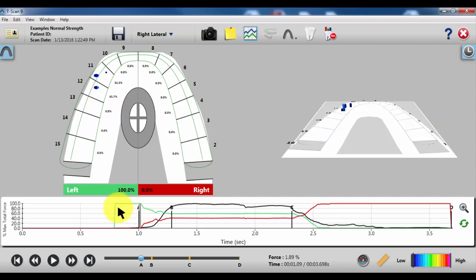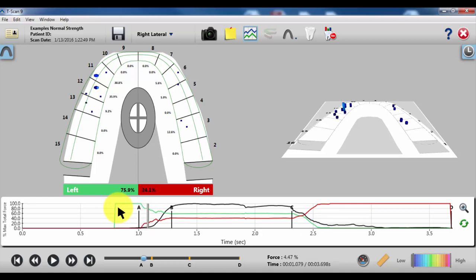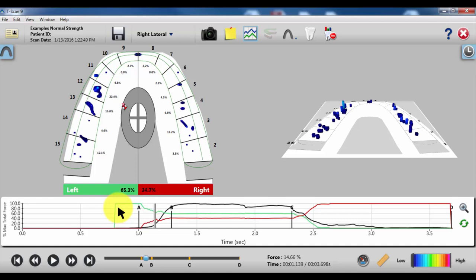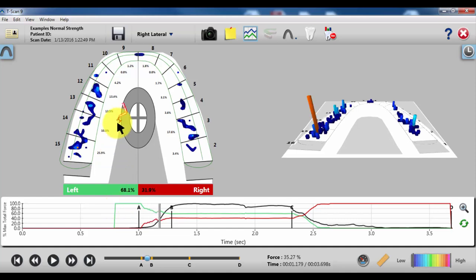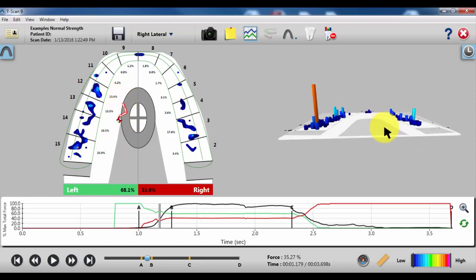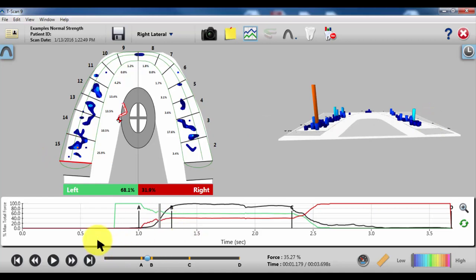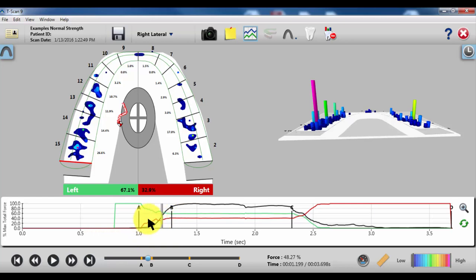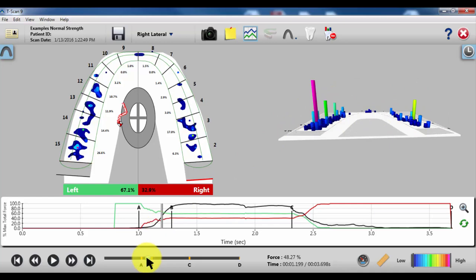If we wanted to find the first contact or first one or two contacts, we would play from the A and click with our right arrow key on our keyboard a few clicks and start trying to find the forces on the left side that are rising faster than the rest. You can see there's 15 right in the center. It's definitely rising faster than the rest. Additionally, there's a few more contacts as the grade bar is moving towards B that you may also find interest in adjusting.